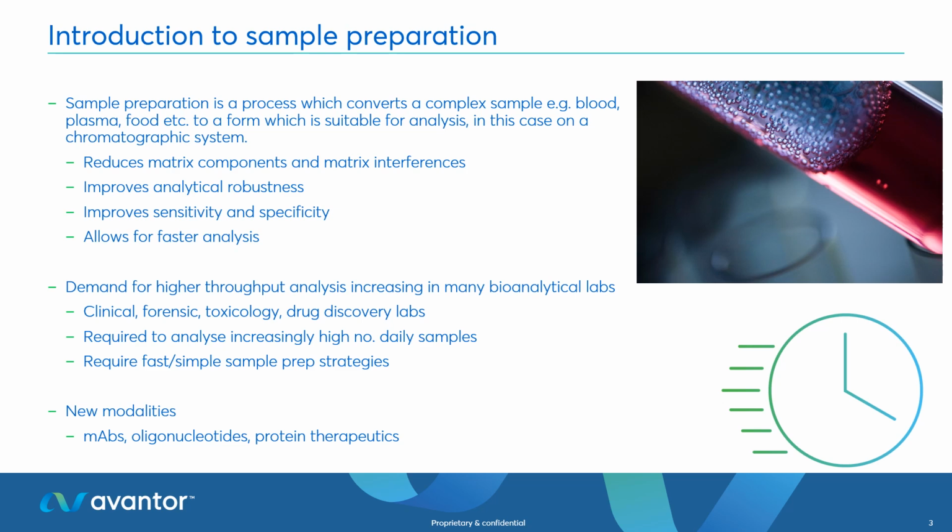This really is being driven by a variety of different industries to try and reduce the analysis time and therefore to think about how we can apply sample preparation in a manner that is going to be beneficial to these different industries. So the demand is coming from bioanalytical laboratories, clinical forensics, toxicology, drug discovery labs, for example, where there is an increasing number of samples due to the way that we live our lives. We all want to be healthier, better, and as a consequence, we need to do more analysis. And this, in turn, requires a fast, simple sample prep strategy.